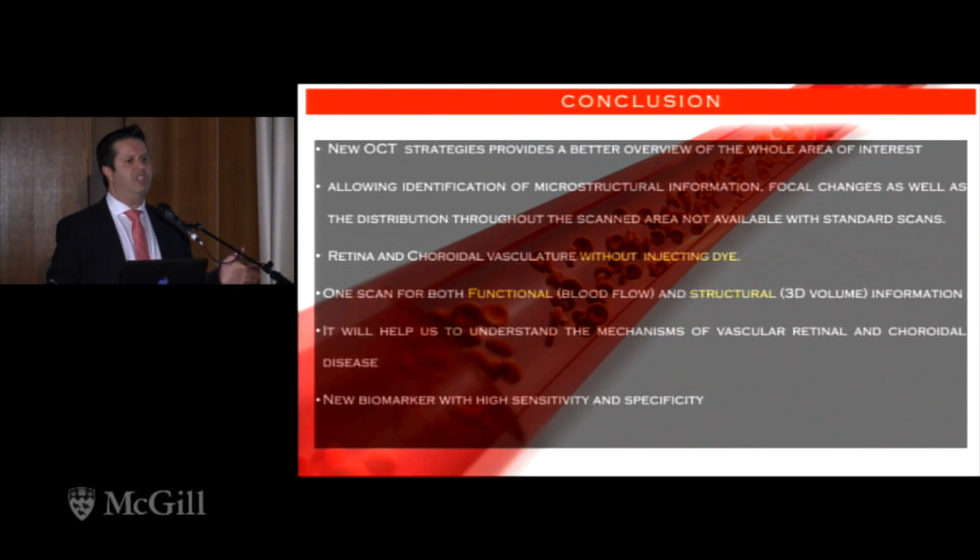And with OCT angiography, you're not using dye anymore. It is really fantastic. If you compare it with fluorescein angiography taking 15 minutes, OCT angiography takes about 2 to 3 seconds. We don't inject any dye. It's very fast. We can assess layer by layer, not only one layer of the retina, but all 4 layers of the retina, including the choroid. So it is really fantastic, very fast, and with no associated risk.